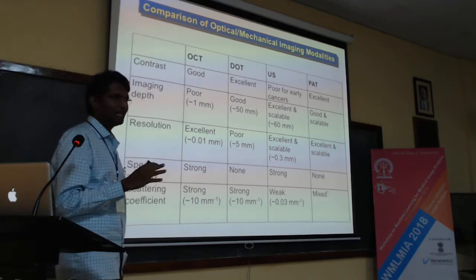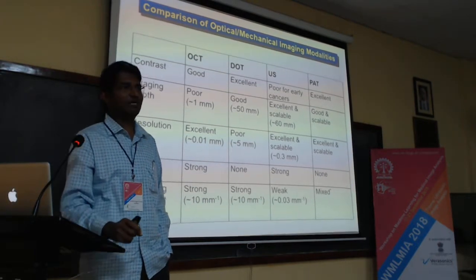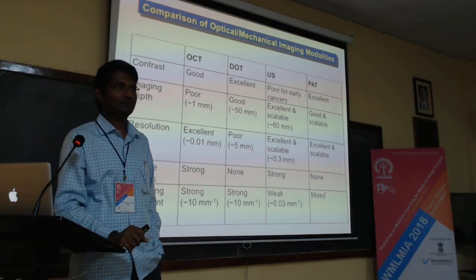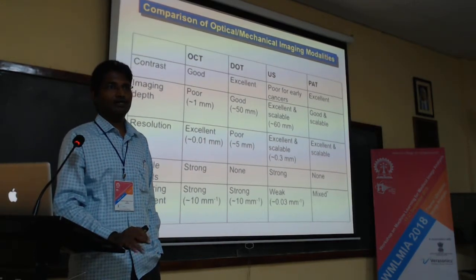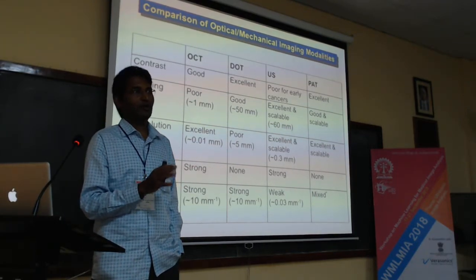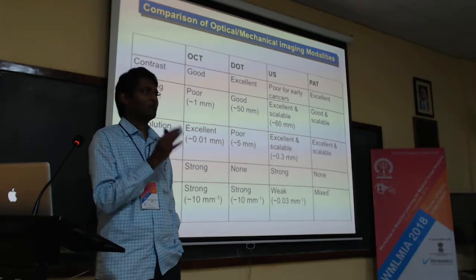So what is the problem with ultrasound? Has anybody understood what the main problem with ultrasound is? Why are a lot of the clinicians not very happy with ultrasound? One of the main problems with ultrasound is that it's always operator dependent. Your image quality depends on who is operating.